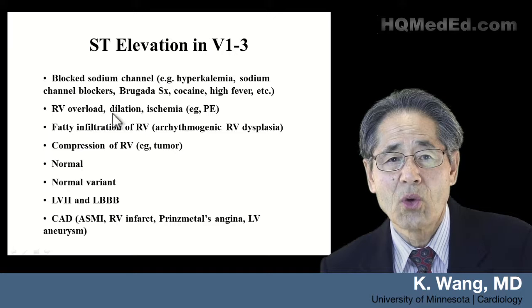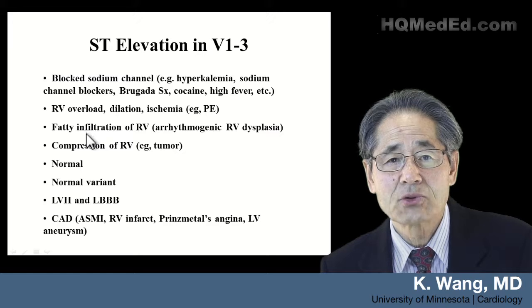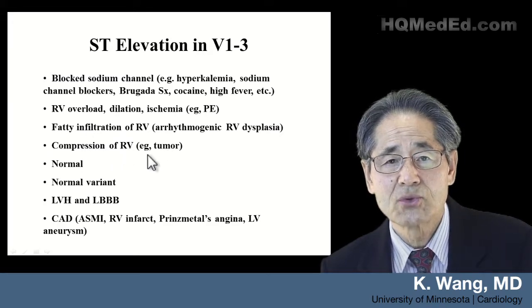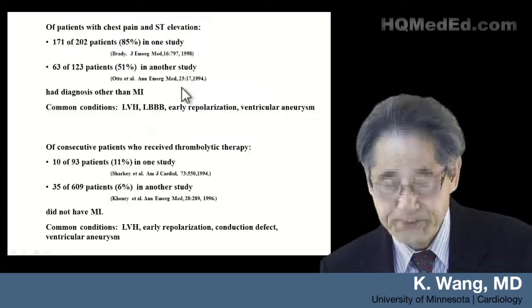Right ventricular overload with severe dilation during PE, or fatty infiltrates, or compression of the right ventricle from tumor, or normal, the most common ST elevation actually, or normal variant, or LVH or LBBB. Of course, STEMI will do that too.